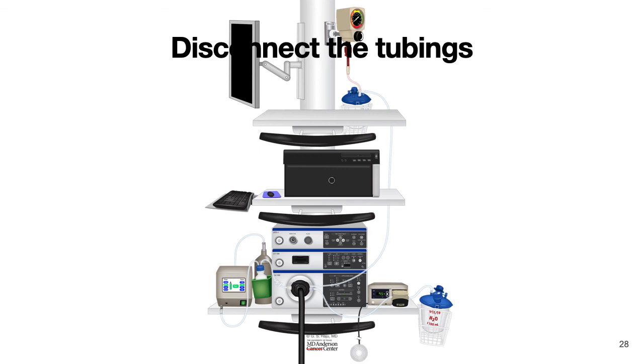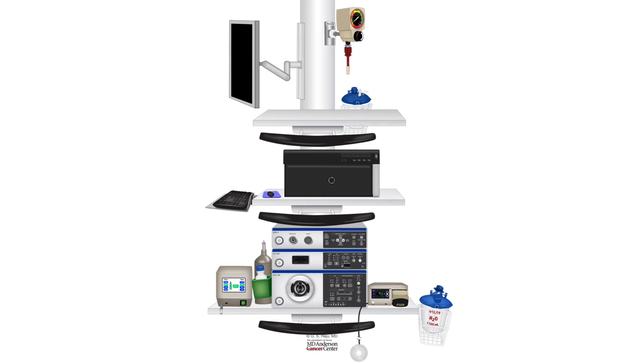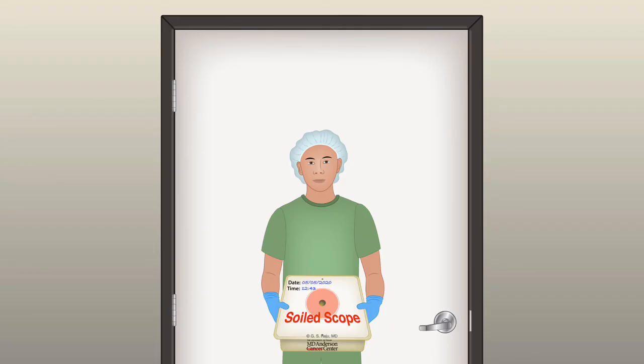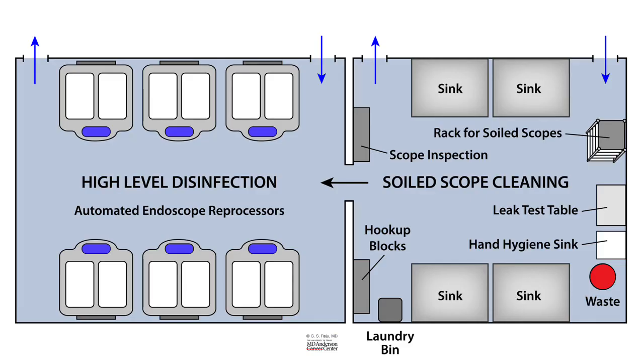Subsequently, we disconnect the tubings and then disconnect the endoscope and place it in the transport bin, nicely coiled with the right-left knobs facing up, and then transport the scope immediately to the high-level disinfection area. And here it goes through several steps of checking for leak first, and then the high-level disinfection process. I hope this is useful. Thank you.